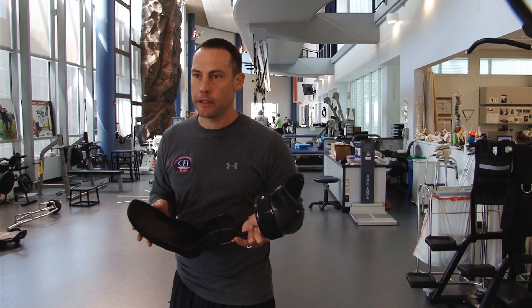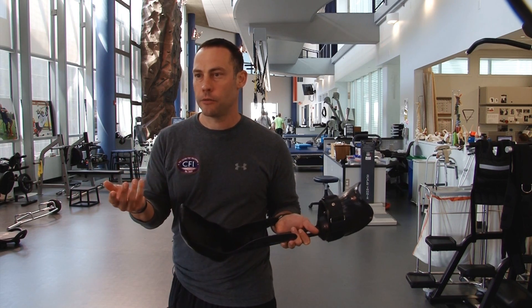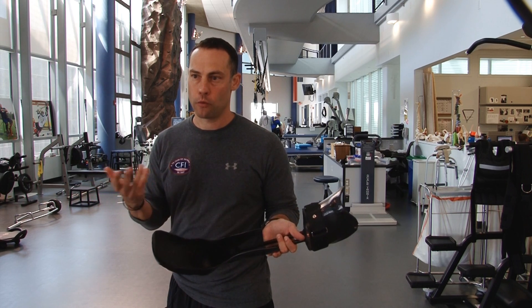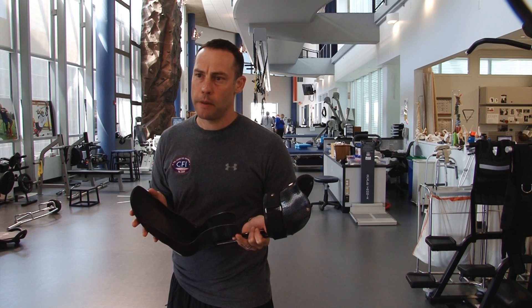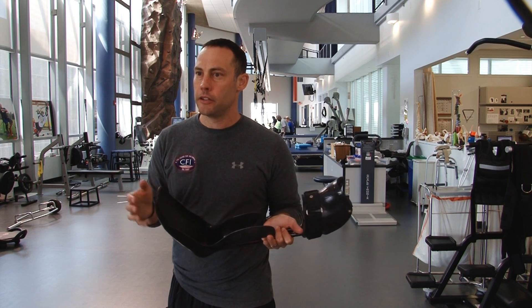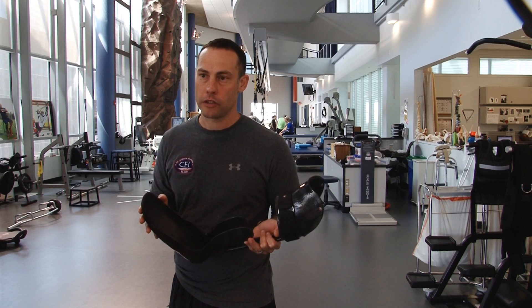The amputees had something to give them some power back in their limb — a prosthetic. So it was allowing them to walk without problems, run, jump, and oftentimes return to duty. For the limb salvage patient, they really only had an injured limb and there was nothing to really help them get that power back.